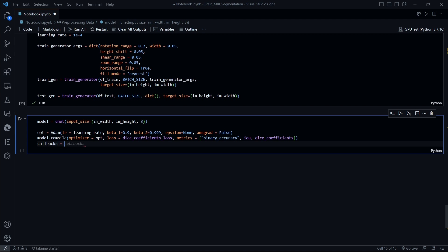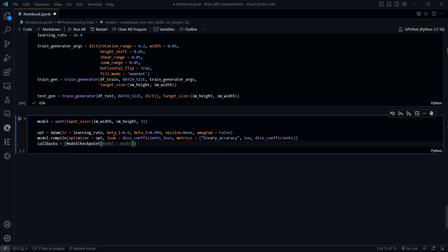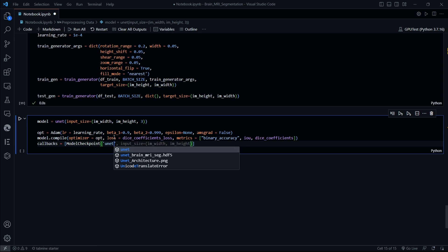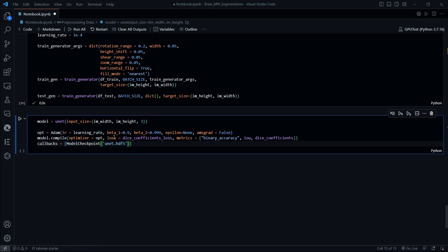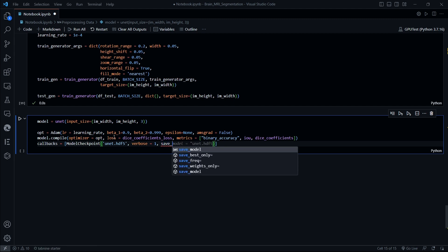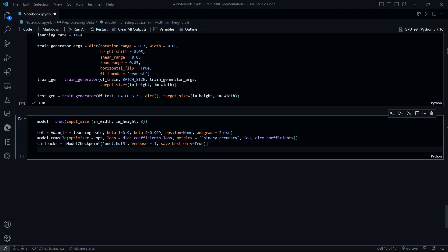The callbacks are defined as model checkpoints, named unet_brain_MRI.hdf5. HDF5 is the extension for our weights or the model that we are going to train. Verbose would be equal to 1, and then save_best_only set to True, so we are going to get the best model out of our iterations.